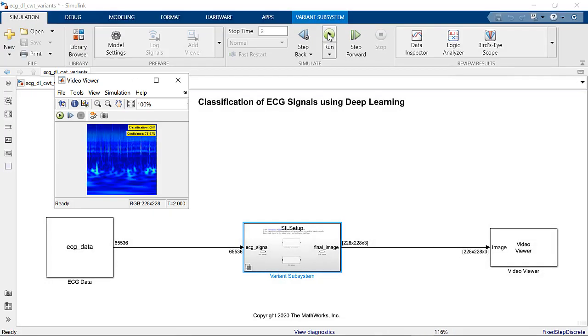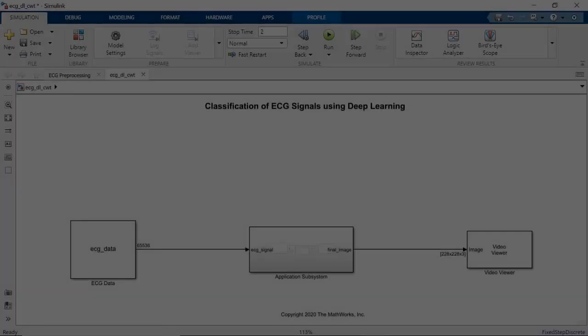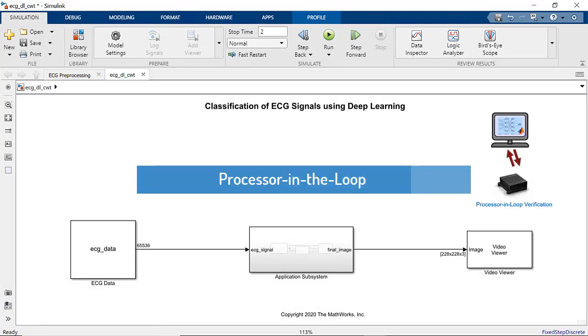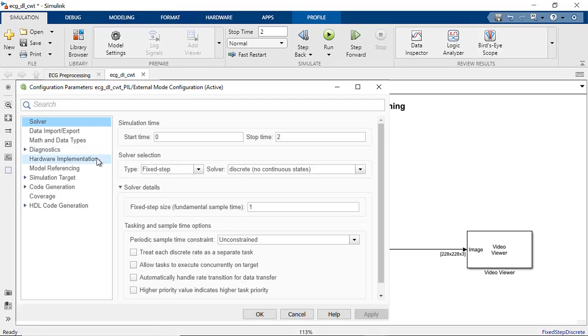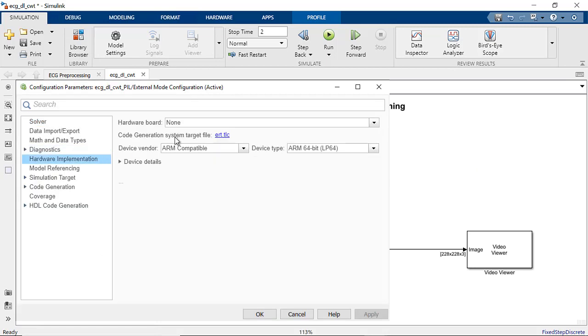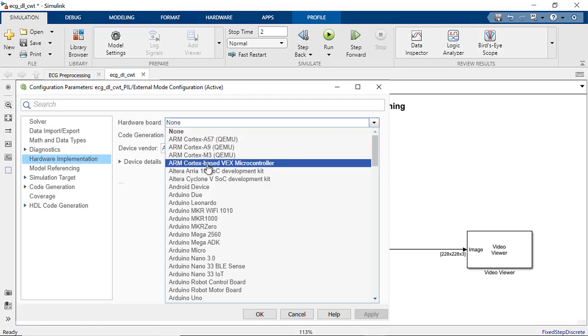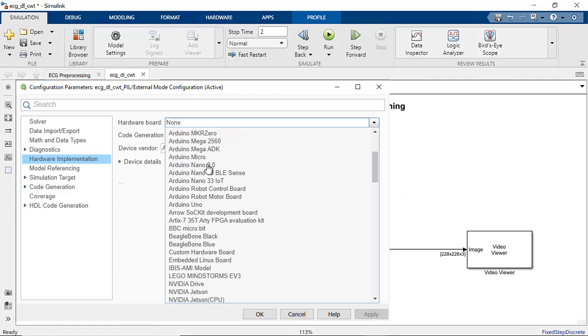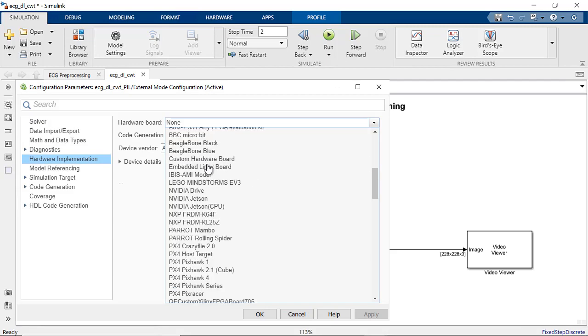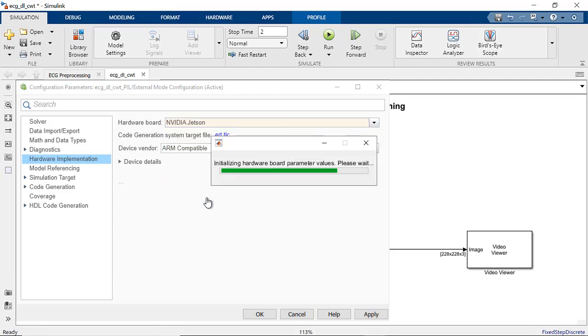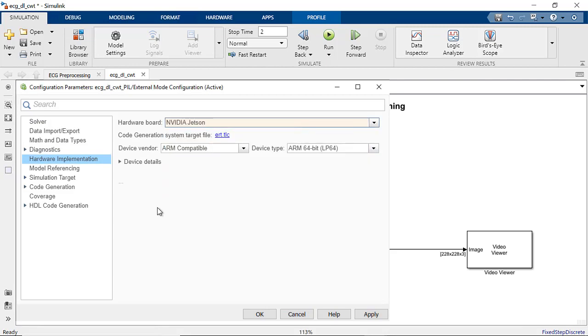With the generated code on the host CPU and GPU verified, let's move to the next step where we verify the generated target code on a NVIDIA Jetson board. To run processor-in-the-loop testing, go to Hardware Implementation tab in Configuration settings and set the Hardware board to NVIDIA Jetson.